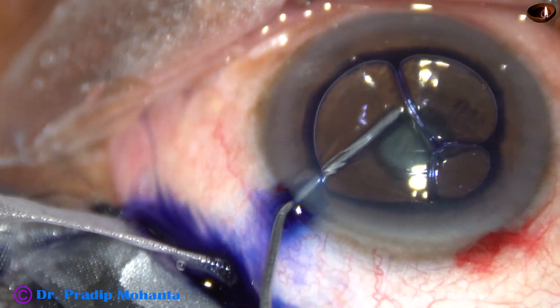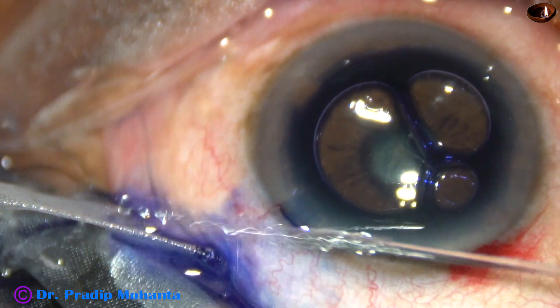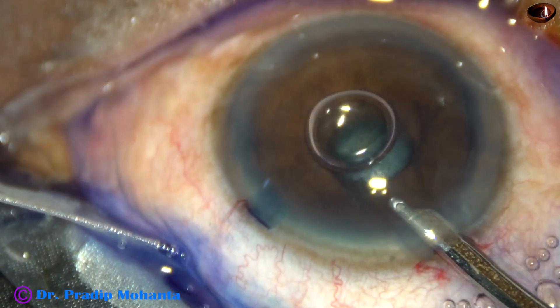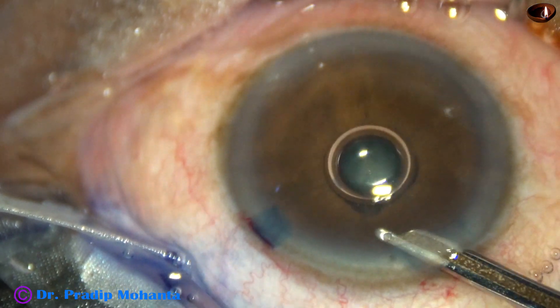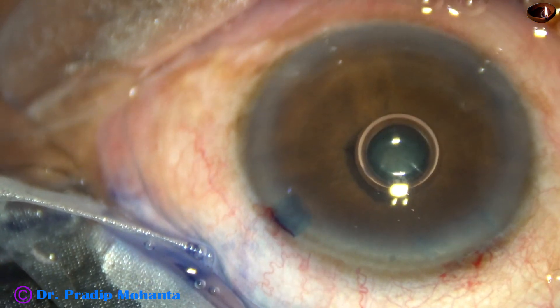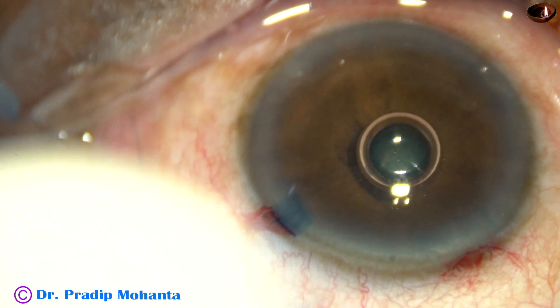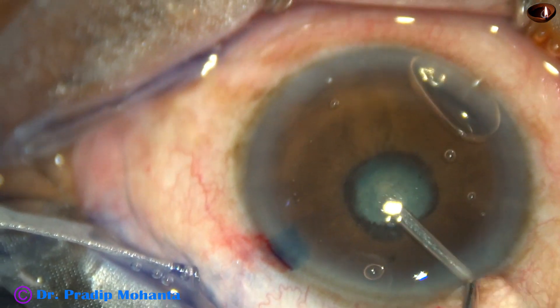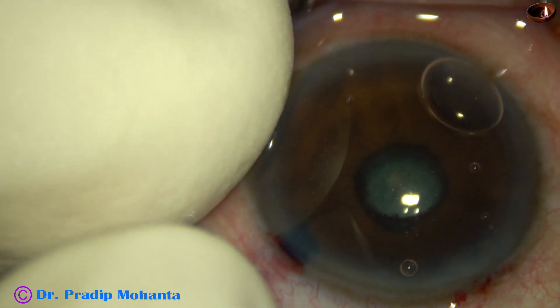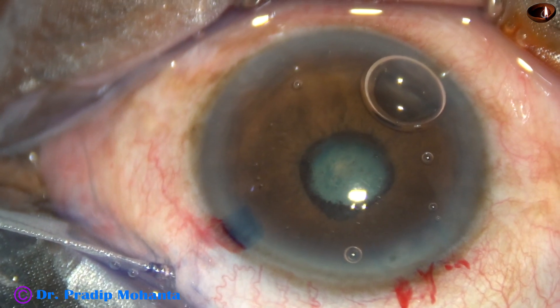By this time, the main incision and side port has been made. Trypan Blue dye has been applied underneath an air bubble. The dye is washed out. The dye has stained only the exposed part of the capsule. I inject some visco and now I am going to break the synechia.